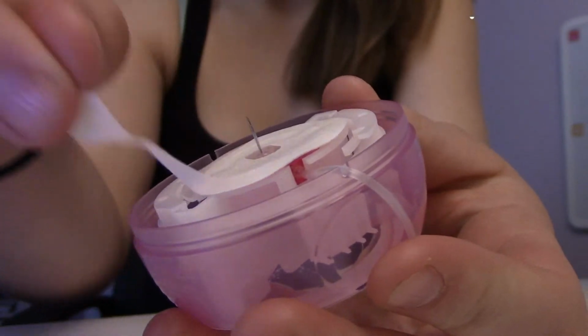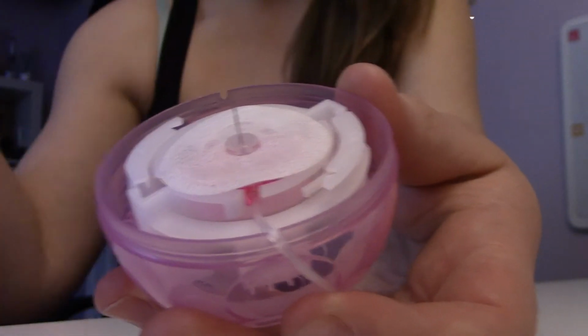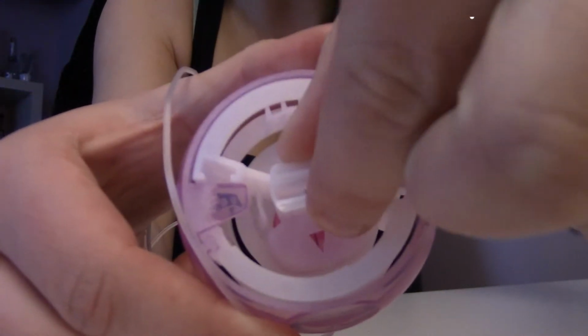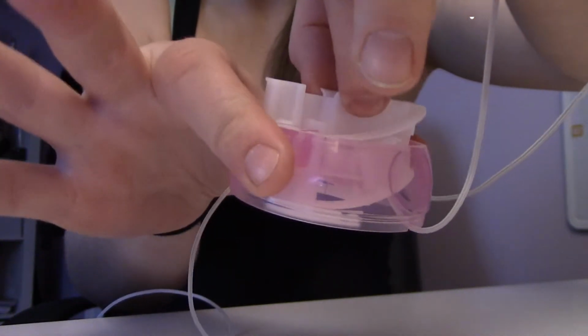Next you're going to do is take off the white part. Unwrap it. Be careful not to pull too hard because you don't want the white sticky stuff to come off. Next thing I'm going to do is I'm going to load it. So there's going to be these kind of white hooks right here. I'm going to take those and I'm going to grab them and pull them up. While you do that, you want to make sure you're holding on to these ribbed sides here and not the indent side. Because if you're holding on to those and you press them, you're going to shoot the insertion site down. So all I have to do is go like this.